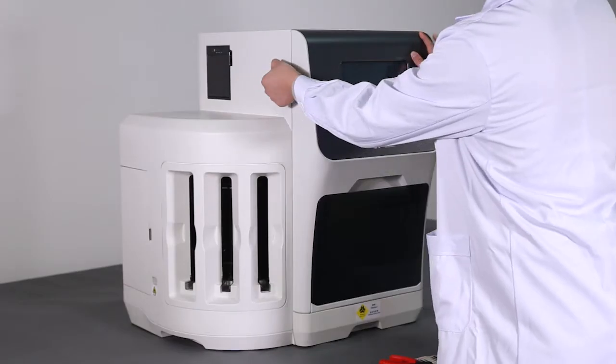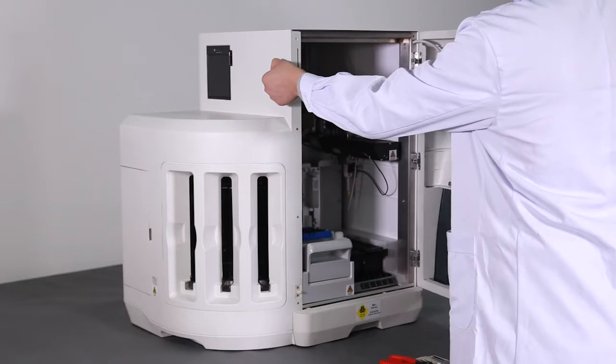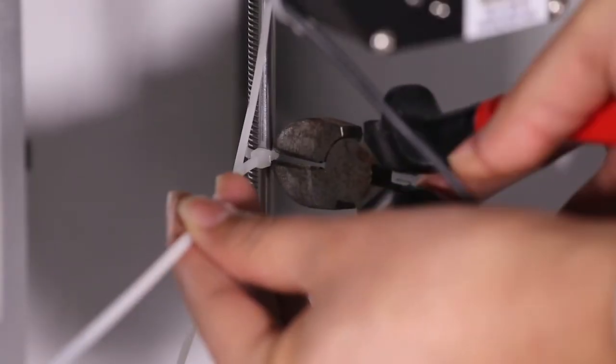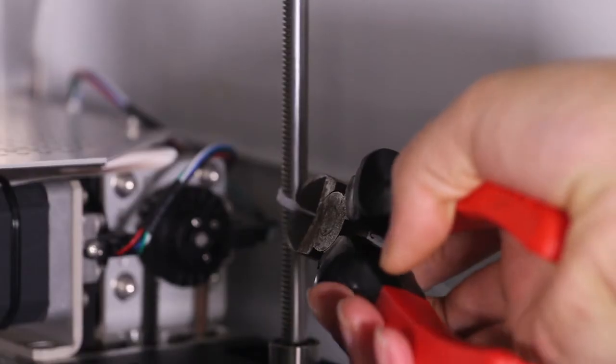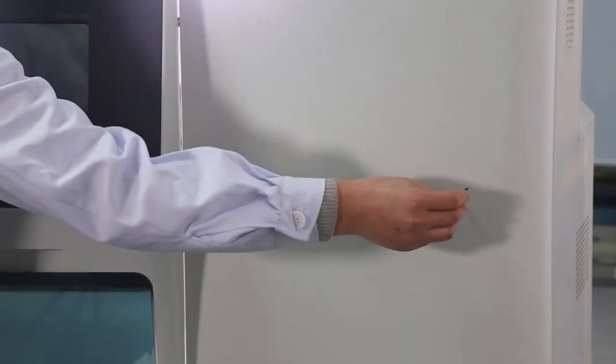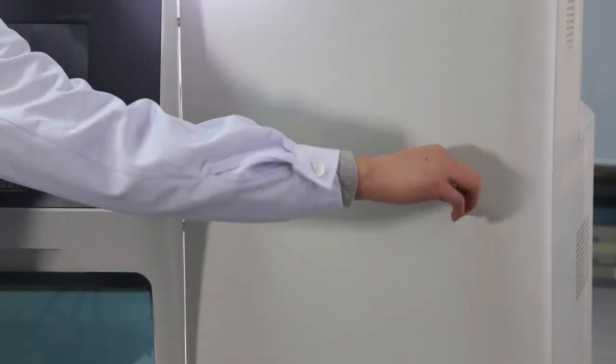Open the sample chamber and cut out the plastic string which is used to tie the mechanical arm. Then use a hexagon wrench to unscrew the screw on the arm retention from its right side.